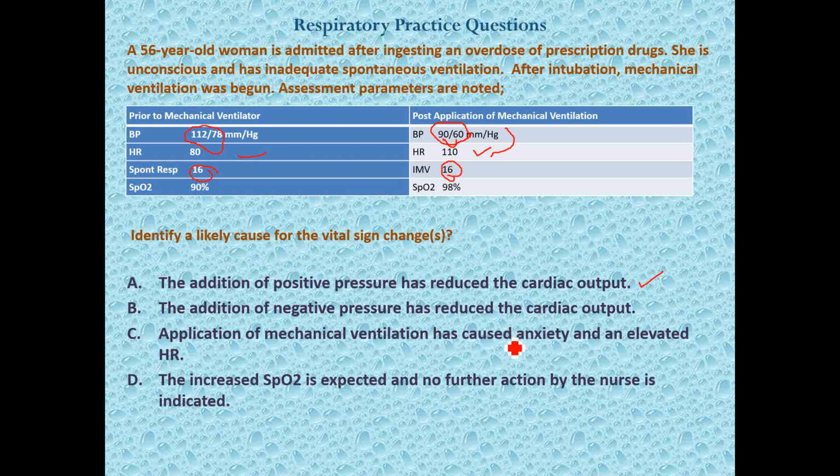But the bottom line is that the way we normally breathe, there is negative intrathoracic pressure. And the ventilator does not wait for the individual to, quote unquote, be ready for a breath. The ventilator just shoves in air whenever it's convenient for the ventilator or whatever the settings have been applied. So that is why all ventilators are considered to be positive pressure ventilators. And positive pressure is against normal physiology.